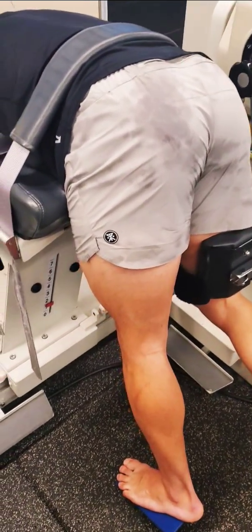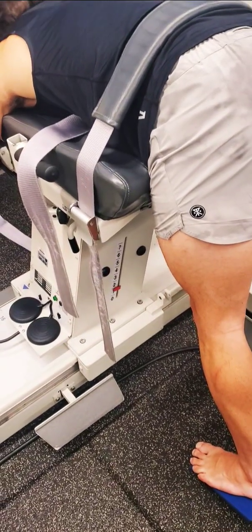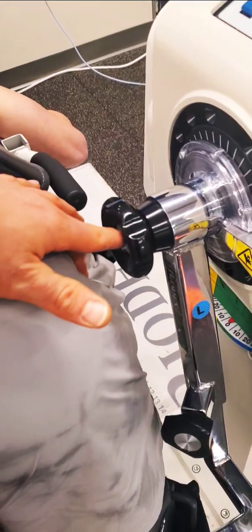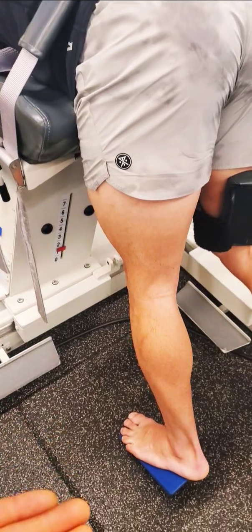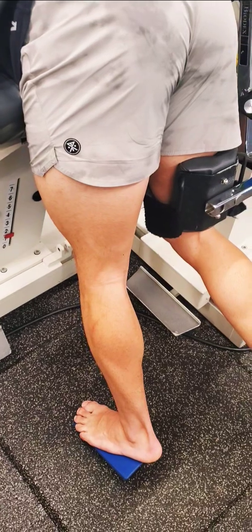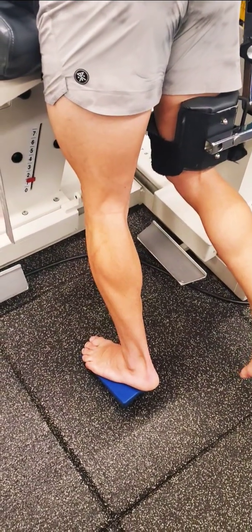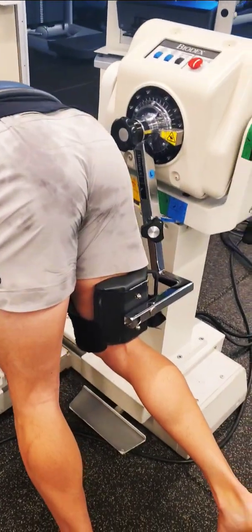Because the chair is already in the fold-down position, it's highly possible that you'll get someone who is of shorter stature, and thus their hip — that is, their greater trochanter — probably may not meet the axis of rotation. In such cases, all you would need to do is put a small stool under that bottom foot. Additionally, we have found that you get better stability and push-off from your base of support when you have a small wedge under that bottom foot as well, irrespective of whether the individual has the appropriate leg length to meet the center of rotation.